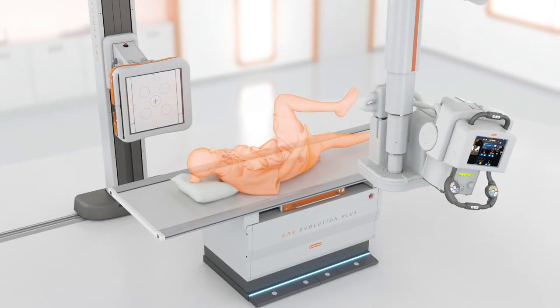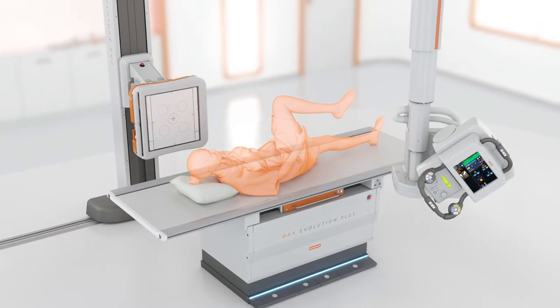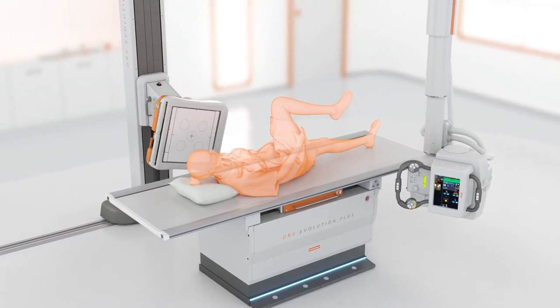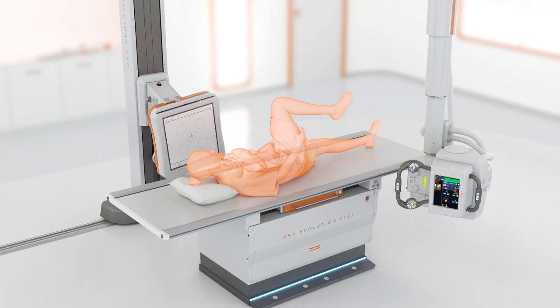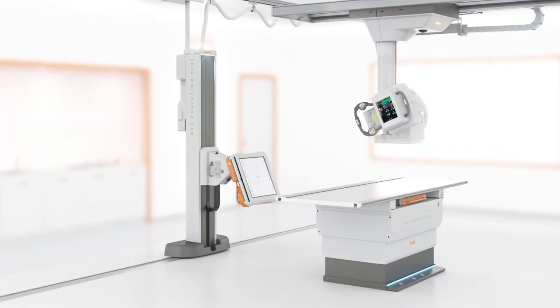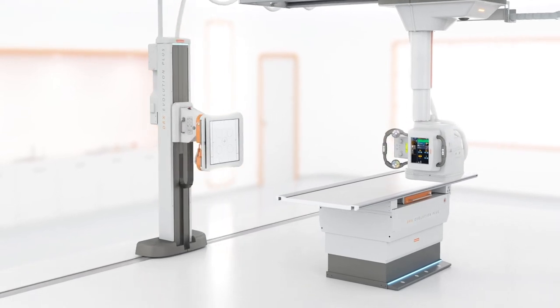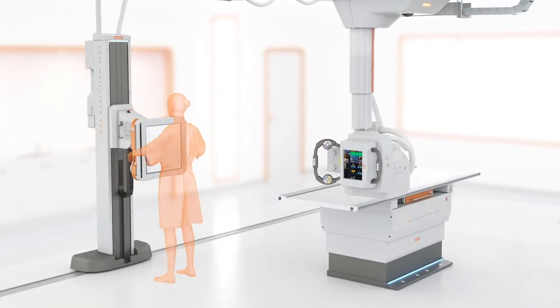Like the table, the wall stand can be fitted with an optional rotating bucky, so that the detector can be quickly positioned from landscape to portrait. Also like the table, while in the wall stand, the detector automatically charges. In addition, an optional floor-mounted rail system for lateral stand movement gives added flexibility to room configurations.